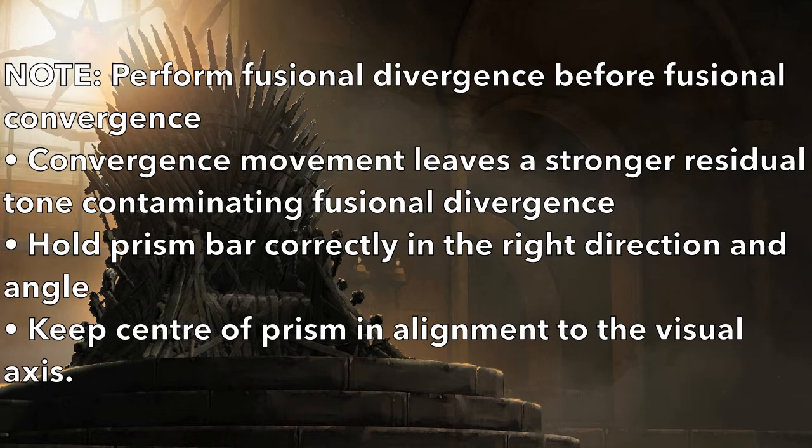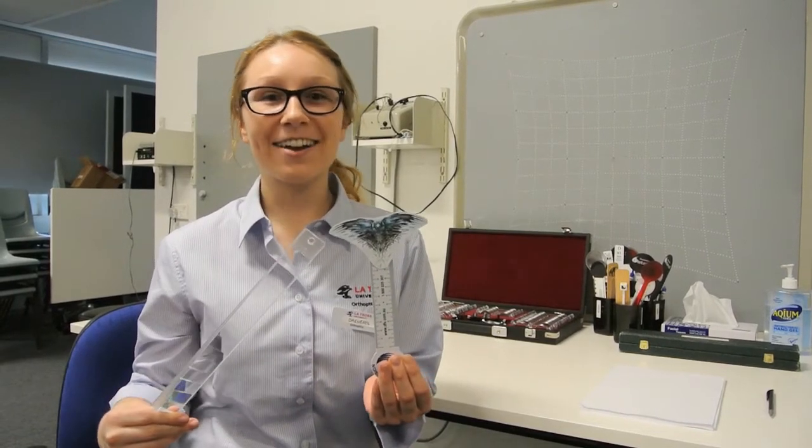Make sure to hold the prism bar correctly, in the right direction and angle, essentially keeping the centre of the prism in alignment with the visual axis. My name is Daenerys and I'm an orthoptist. Today we're going to be looking at the prism fusion range. This test involves assessing how well a person's eyes can diverge and converge while maintaining single vision, and can be done at either one third of a metre or at six metres, using instruments such as a prism bar and a fixation target.